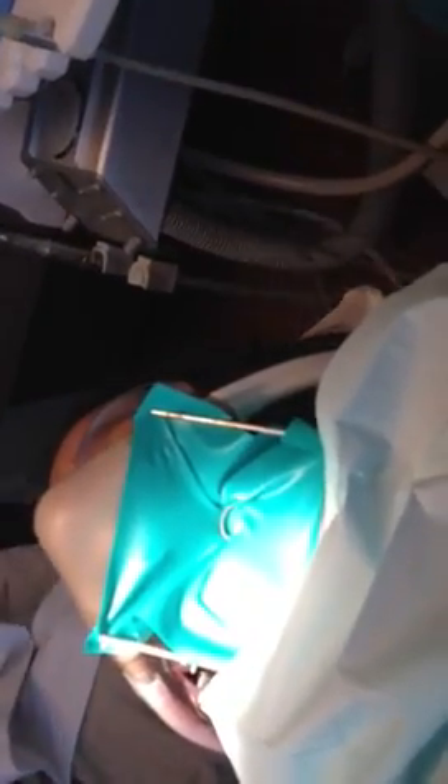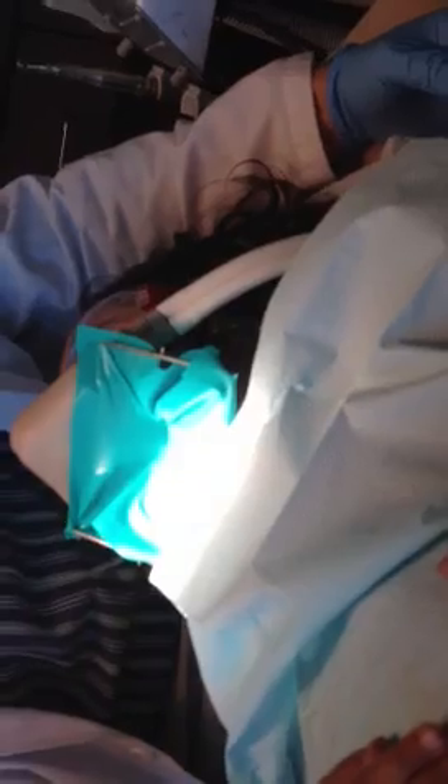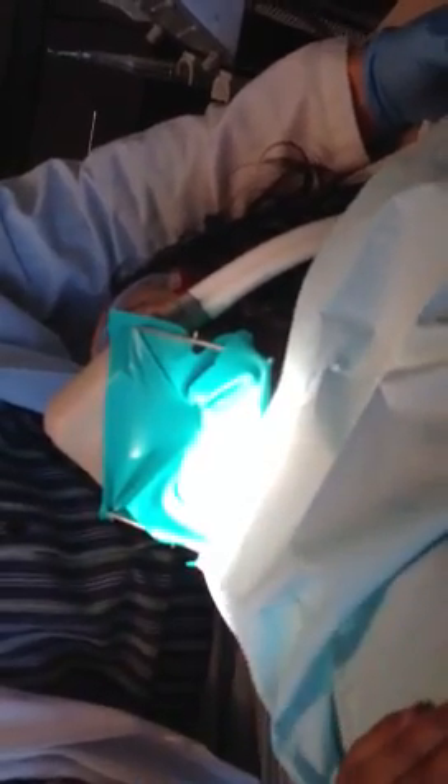All right, kiddo. Put on my specs too. This is Mr. Thirsty — he's going to drink up all the water. And my tooth washer — I don't know if you remember that from last time or not — it's the one that sprays all the water. So you're going to feel a whole bunch of water on your tooth, but it's just cold water. No big deal.